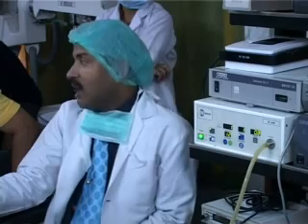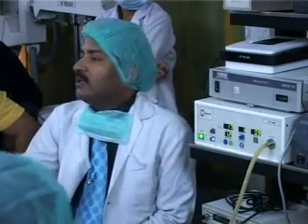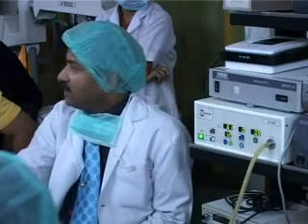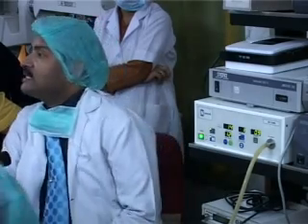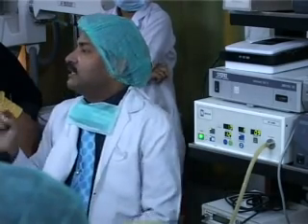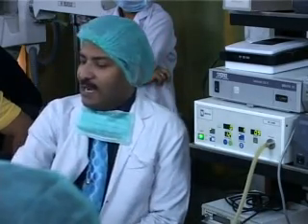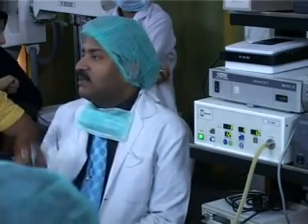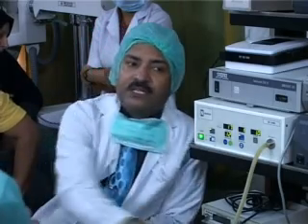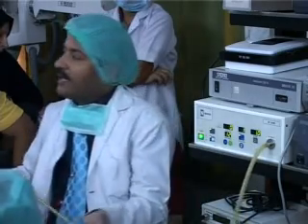If you block, then the pressure will increase. So it will be initially pulsatile flow, and later if you detach the insufflator, automatically it will become continuous flow. It is resistance of the flow due to the small eye of the Veress needle, because the gas has to flow under resistance. Again, if you attach it with the cannula, then the error will automatically stop. It will start giving you continuous flow. So this is with every insufflator. Once you attach it with the Veress needle, it gives you error.